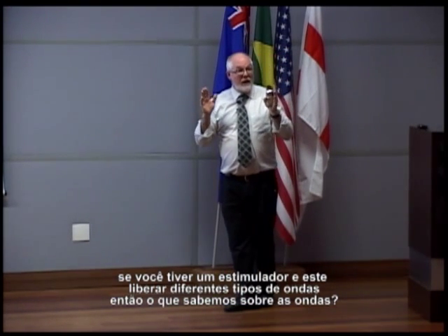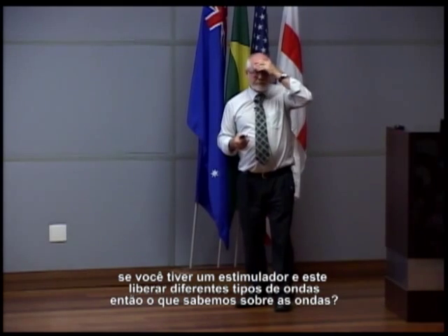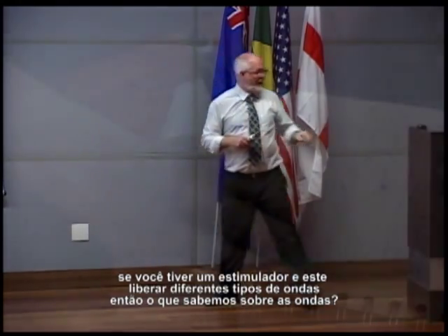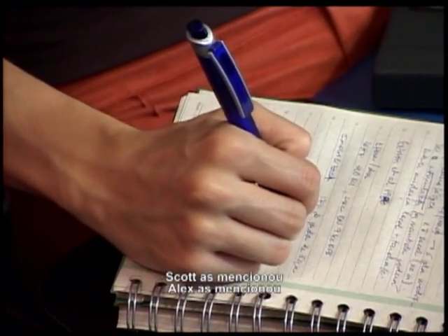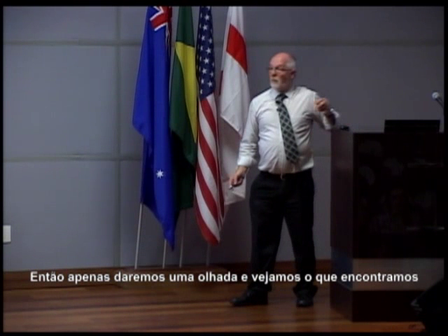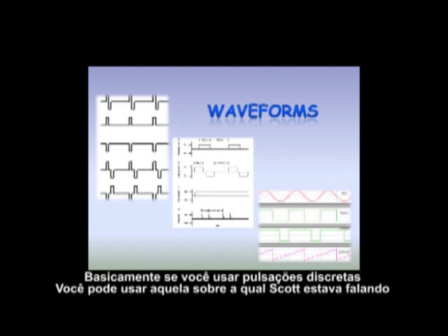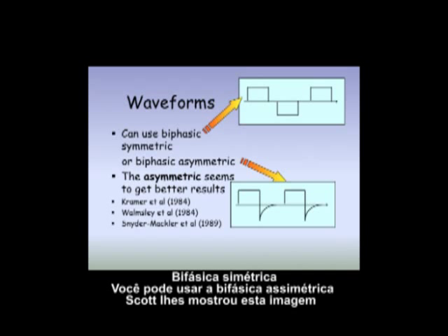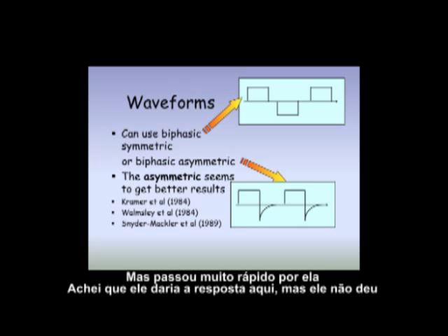Okay, so if you have a stimulator and your stimulator delivers different kinds of waves, then what do we know about the waves? Scott's mentioned them, Alex has mentioned them, so we'll just have a look and see what we can find. Basically, if you use discrete pulses, you can use the one that Scott was talking about, which is biphasic symmetrical, and you can use biphasic asymmetrical. And Scott showed you that picture and then went past it very fast. I thought he was going to tell you the answer here, but he didn't.